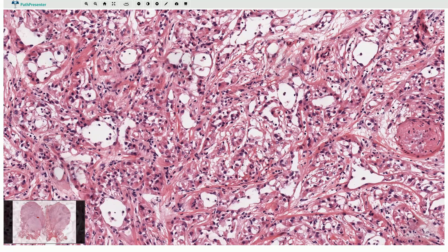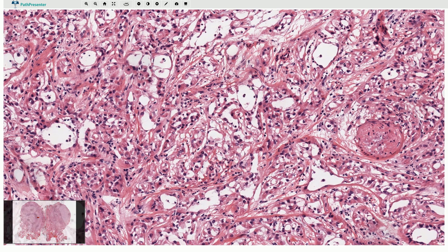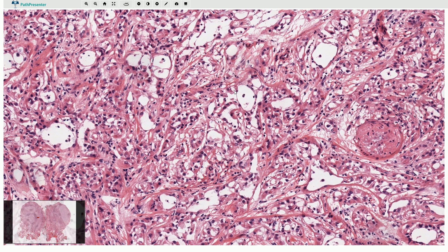We recognize a few morphological patterns of adenomatoid tumor. One of them is angiomatoid or canalicular, and this is probably this case — a lot of these empty spaces look like vascular channels lined by flattened endothelial-like cells.